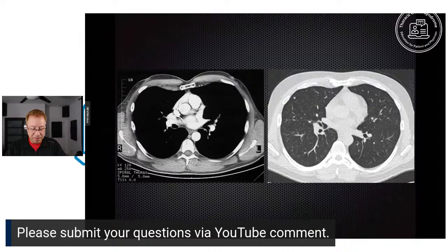Those are the ribs. Now the image on the right is where we've manipulated the windows a little bit and we can see the detail in the lung. You'll notice that it's much harder to see the bones separated from the soft tissues or to see the contrast in the heart and blood vessels. So it's really the same image, but you're just changing how the computer presents it on your screen.